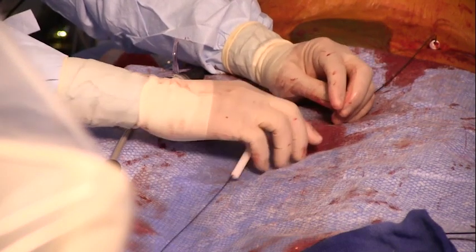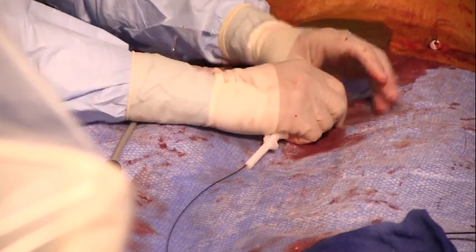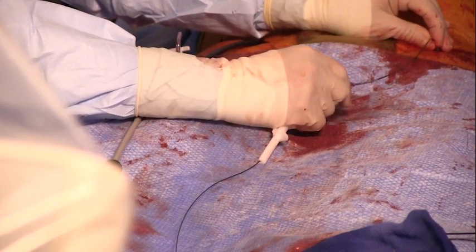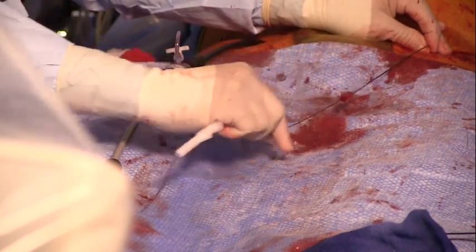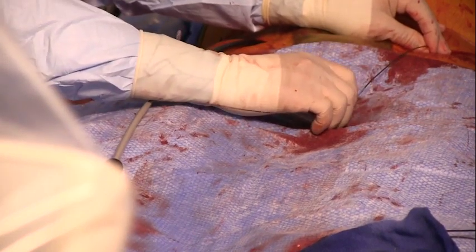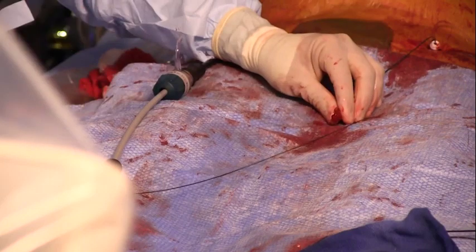Most practitioners will opt to swap the pigtail catheter out for a KMP or similar catheter unless the angle to cannulate requires a complex curve catheter, in which case a SOS, VS, Van Schie 5 or the like may be chosen.